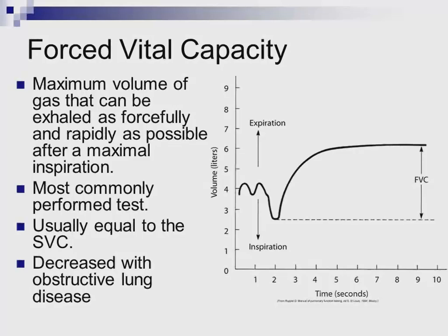And graphically, this is what it would end up looking like. I have my tidal volume starting off here. Take a deep breath in, deep. Now blow it out, push, squeeze.